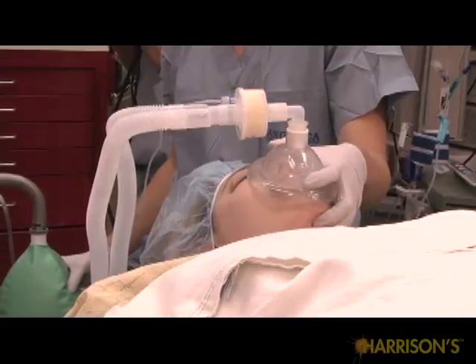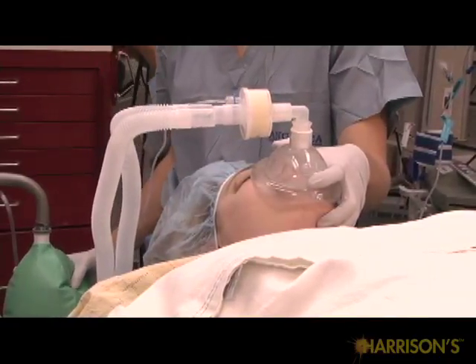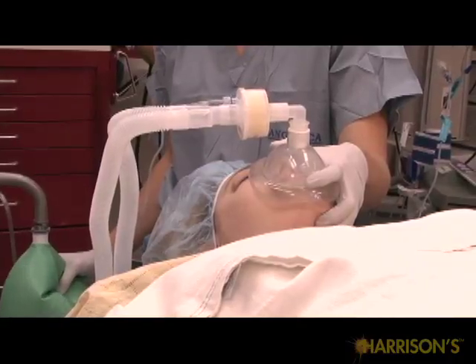Assess the adequacy of mask ventilation by chest rise, breath sounds, tidal volumes, and capnography. If you are unable to ventilate, it is important to immediately call for help and to prepare for insertion of a laryngeal mask airway, or LMA.